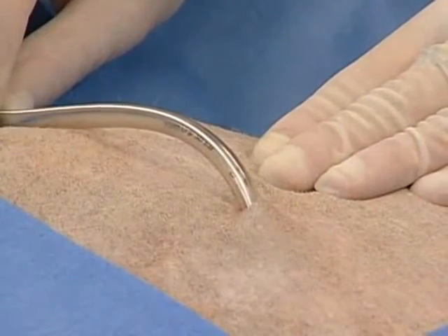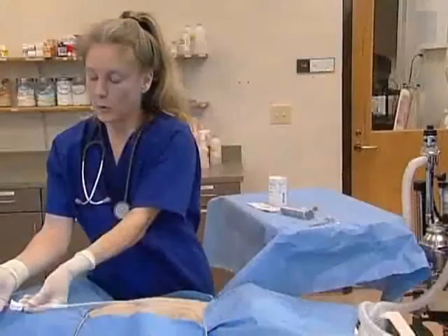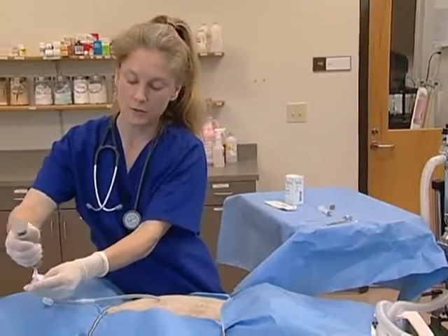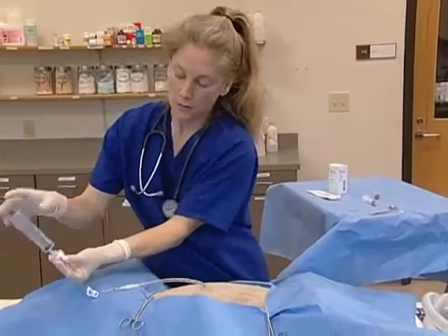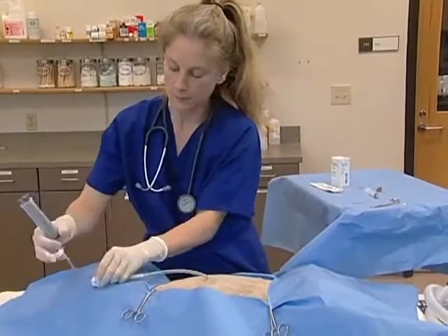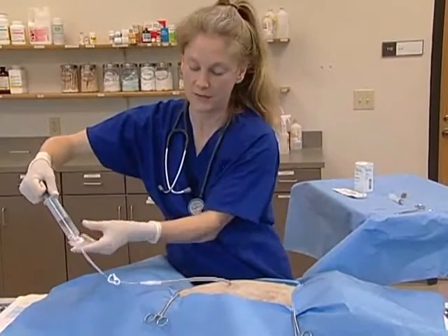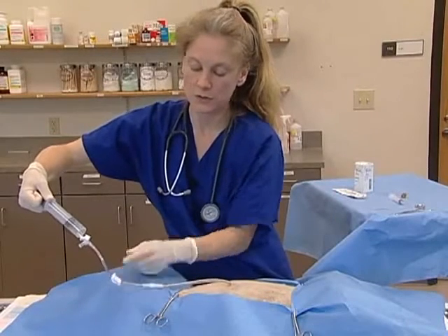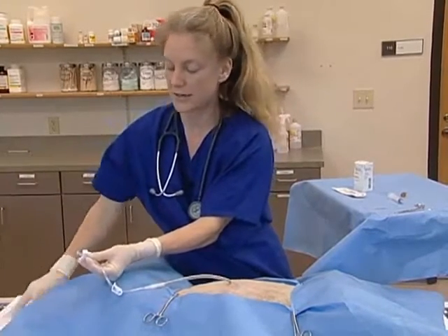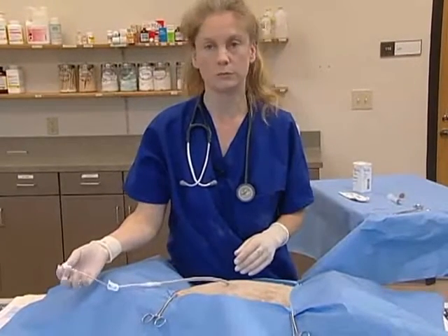Once you have properly inserted the chest tube, your assistant releases their hold on the skin, allowing it to fall back and create a subcutaneous tunnel. With your tube in place, attach a syringe to the end of your adapter, turn your three-way stopcock off to the environment, release your clamp, and aspirate any air and/or fluid that may have accumulated within the chest cavity. Once that has been removed, clamp the adapter again, turn the three-way stopcock off towards the patient, remove your syringe, and place a male adapter plug at the other ends of your three-way stopcocks.